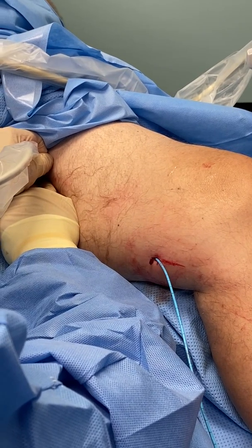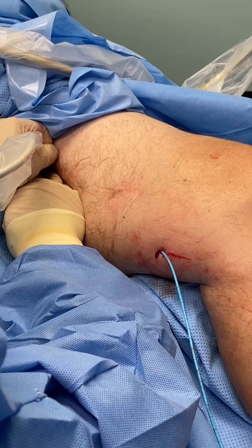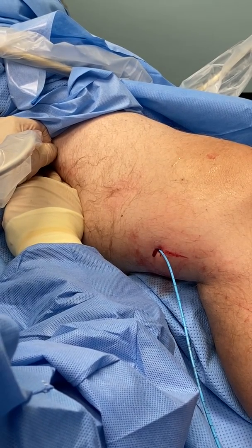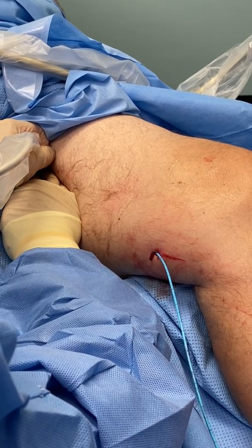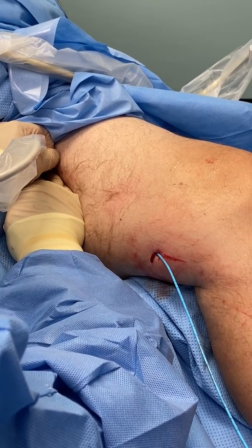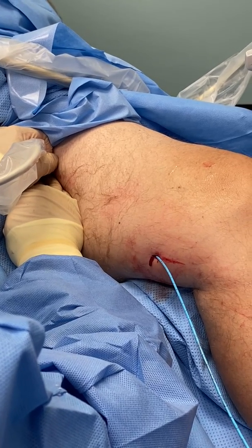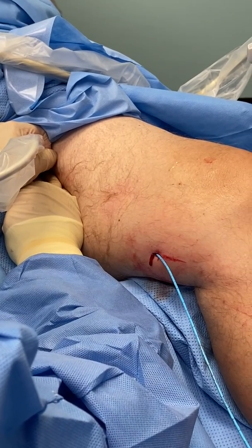The advantages of this procedure is that we did not have to do any type of anesthesia around the vein, which is required for the thermal ablation techniques such as endovenous laser or radiofrequency. So this procedure requires no anesthesia, so it's a lot more comfortable for the patient. Also, the patient does not have to wear support hose afterwards. The patient agrees with me on that.